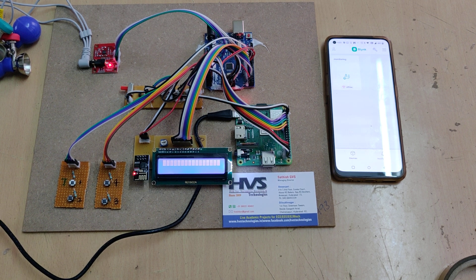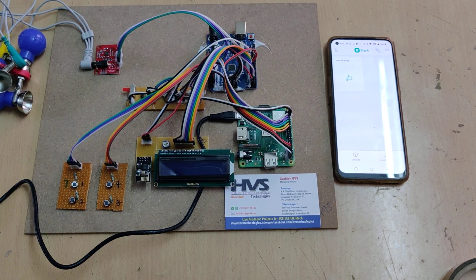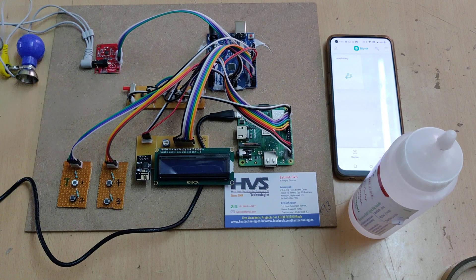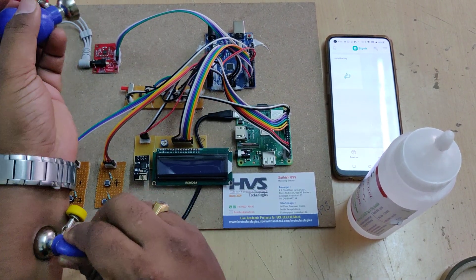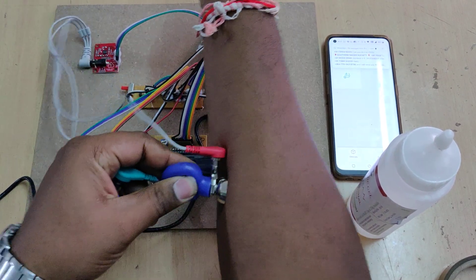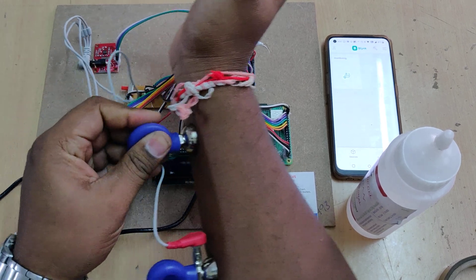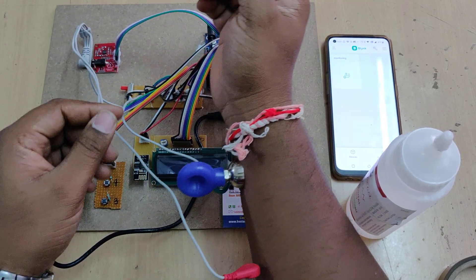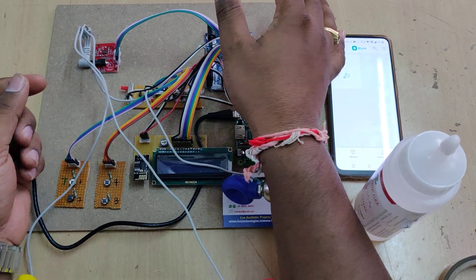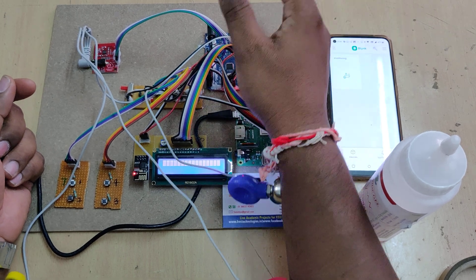Now power on the Raspberry Pi and wait for around 10 to 15 seconds for booting to complete. You need to mount the electrodes — apply the ECG gel and place the electrodes on your body. The yellow color electrode should be on the left side and the red color electrode below the right hand side. The other electrode goes on the right hand side.